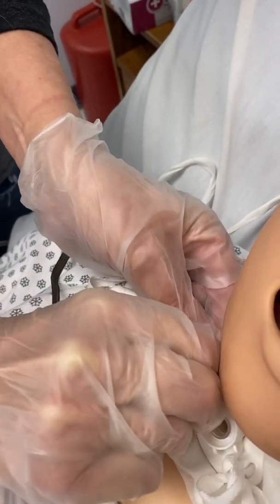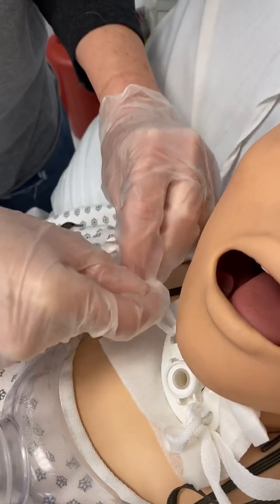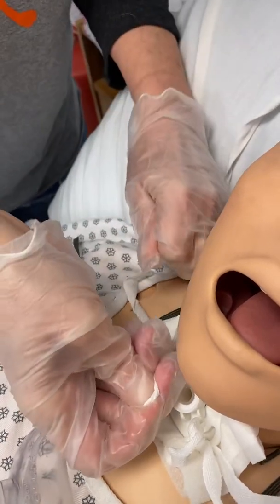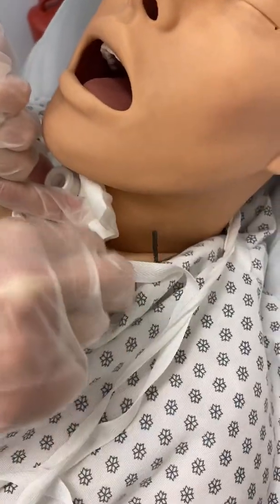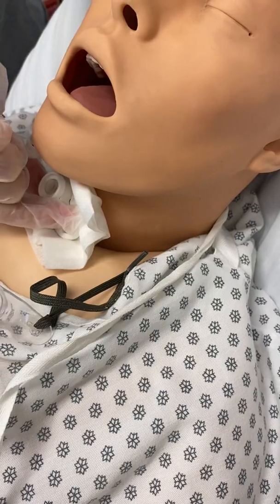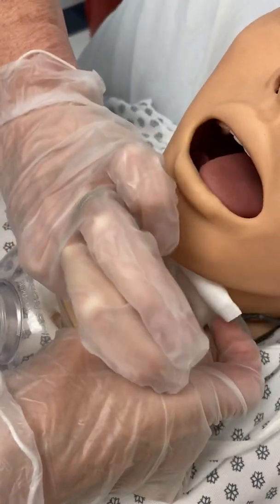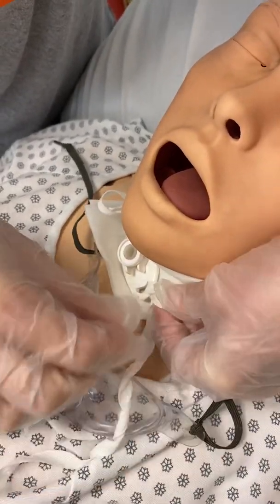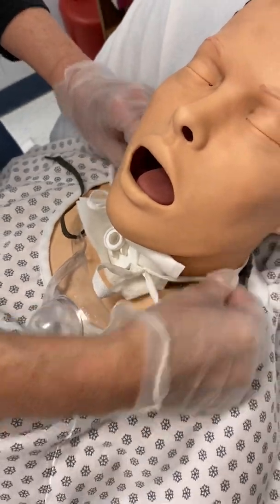We're going to tie our ties. Okay, to do a loop knot, let's see if we can do it the best way for a video. You're just going to tie half a bunny ear, so it's like a bow but not pulled all the way through. Get it tight. Come around the patient's neck. Undo the other one. Get rid of this one. Pull it right there. It needs to be a little bit tighter.